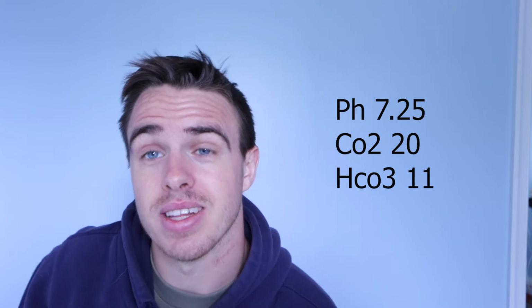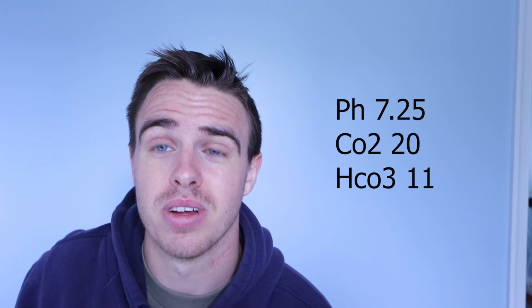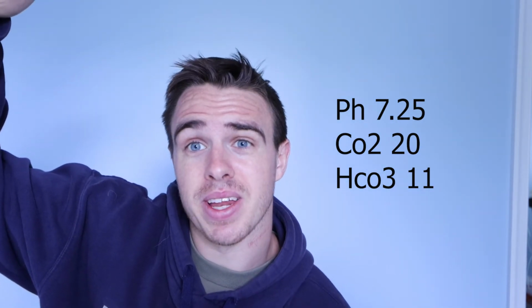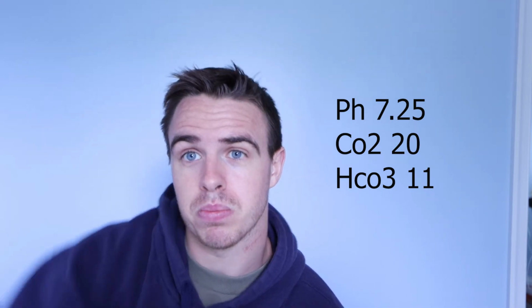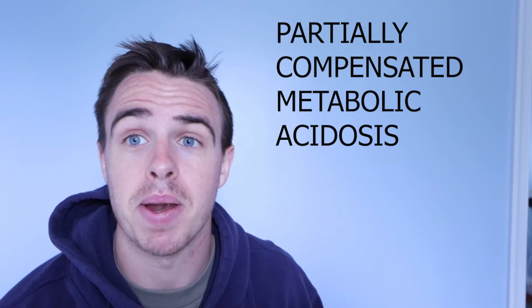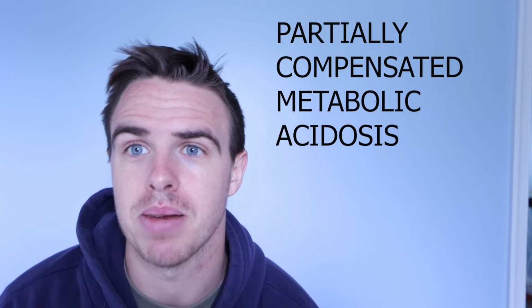So, okay, let's look at what a CO2 of that would make the pH do. So a CO2 of 20 would make the pH go up, right? But then, so we should have an alkalytic pH, right? Except you look at the bicarb, and the bicarb is very, very acidic, which brings it way down past our normal value, which kind of is the reason why our pH is so low. So if you look at this one, it's a partially compensated metabolic acidosis.